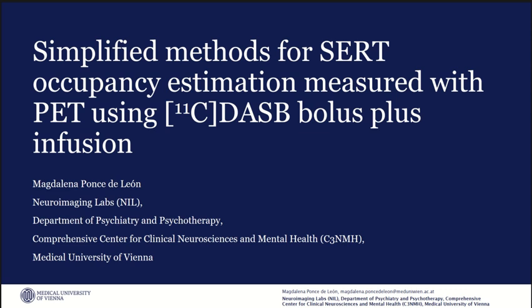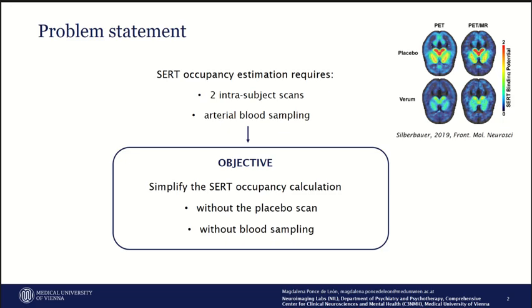I will present simplified methods to estimate serotonin transporter occupancy in a PET study with bolus plus infusion of DASB radiotracer. On the right, you can see the SERT binding potential after placebo or citalopram application.